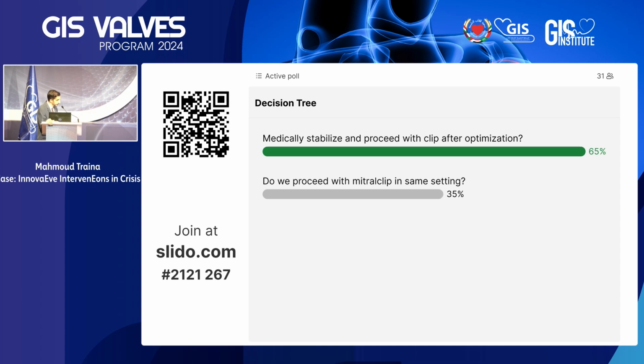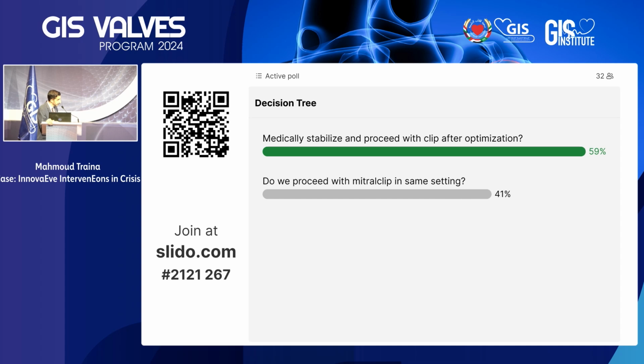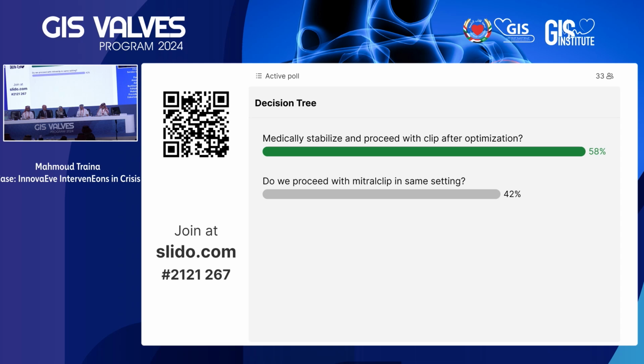Dr. Adel Tash, if I called you now on the table, told you I finished the TAVR and the patient is still in shock, would you consider taking him for repair, for example, or what would you tell me? What do you want to know more? Well, I think from the start, the culprit for the cardiogenic shock is the coronaries, the myocardium, and the sequel of a severe MR. So probably fixing the aortic valve was not addressing the culprit. I would step back. If we cannot address the coronaries by intervention, we need to address them surgically, and fix the mitral valve and do the complete job. But now, I would definitely go for the clip at the same setting. Otherwise, the patient would still be on inotropic support and intra-aortic balloon pump.